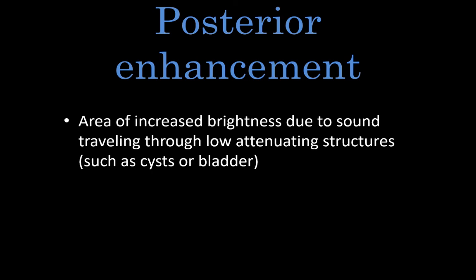Posterior enhancement, or posterior acoustic enhancement, is an area of increased brightness due to sound traveling through a low attenuating structure, which is commonly a fluid or liquid-filled structure. When sound travels through a liquid-filled structure, there's much less acoustic attenuation of the signal. So this causes the structures deep to the fluid-filled structure to appear much brighter. This is useful in certain situations, such as when you're trying to image a fetus behind the bladder. The bladder is used as an acoustic window.